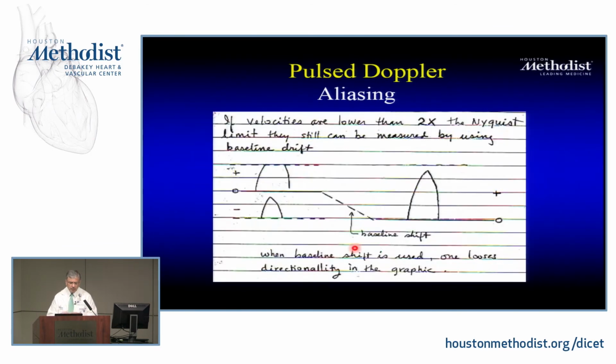Now we could do some tricks. I mean, here, and that's the phenomenon of aliasing. If I can't resolve it, it's going to wrap around. It's going to look funny. If the velocity is much faster, I can't tell a thing. But at times, I can reconstruct this.